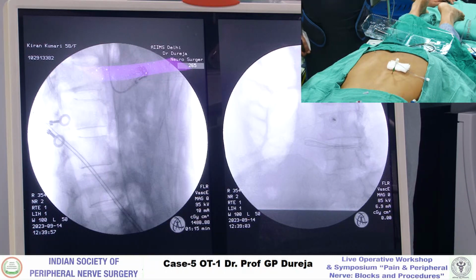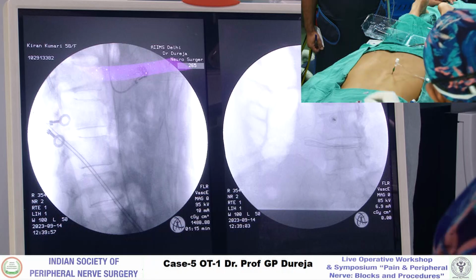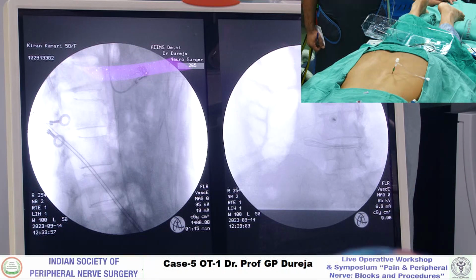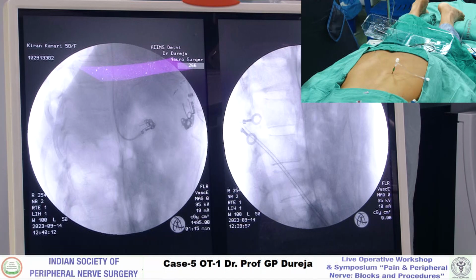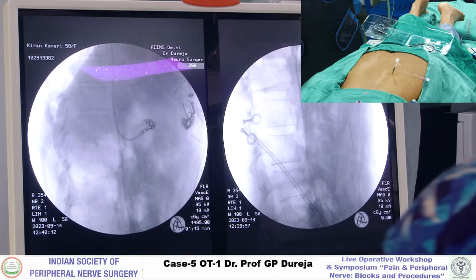Okay. I'll just show you. एक कोई needle दिखाना मुझे. एक कोई needle है. हाँ. Shoot please, shoot. अरे अब तो वो lateral आ गया ना. मैं आपको दिखाऊंगा अभी. Right, sir. शेखर साहब क्या कर रहे हो इधर? हाँ. शेखर साहब को समोसा खाना है भाई.